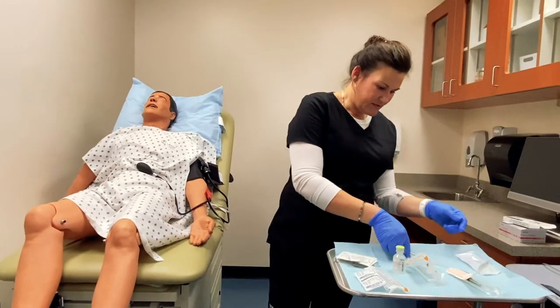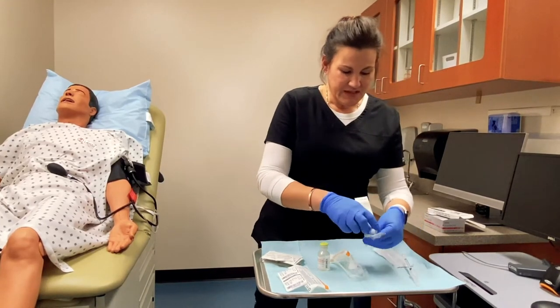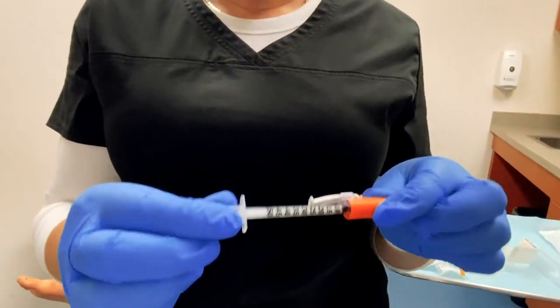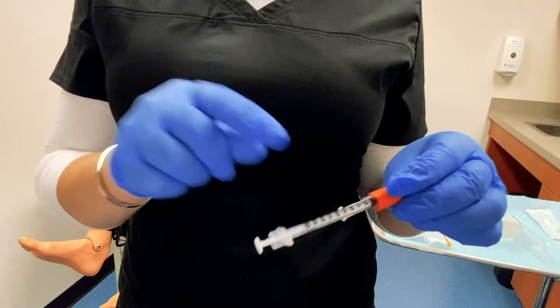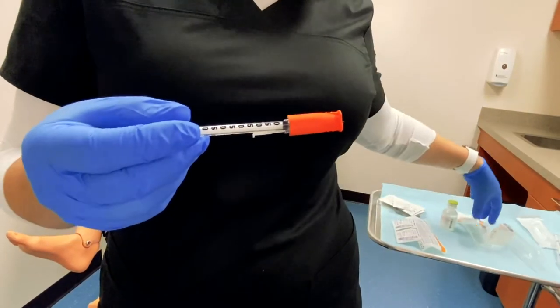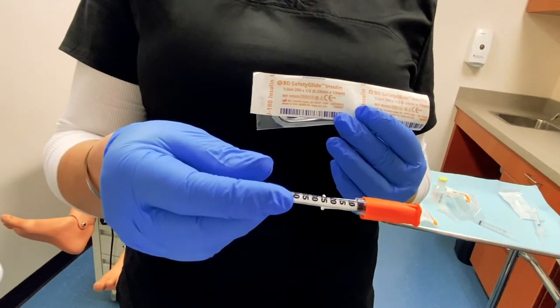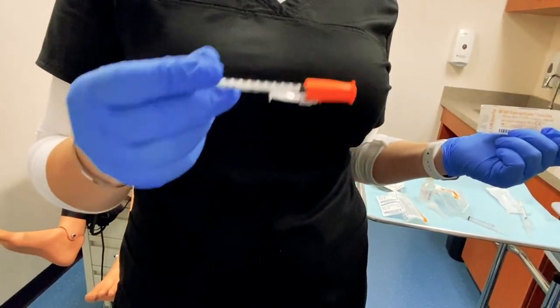I'm going to put the safety cap back on and move on to the insulin needles. The insulin needle is very similar to the tuberculin needle in size — it also only holds one mil, but that mil is broken down into units. This one actually only holds 50 units, which is half a mil. Most insulin syringes will hold 100 units, which is one full mil. The needle size is also similar: it is a 29 gauge, a little bit smaller and shorter, at half an inch. The way needle gauges work is the higher the number, the smaller the needle.